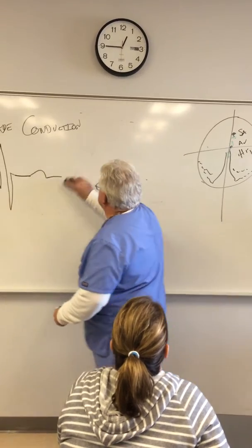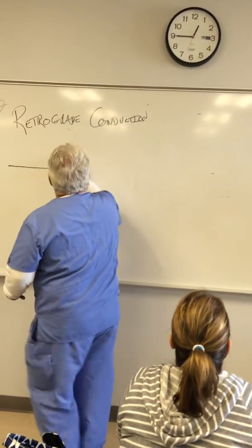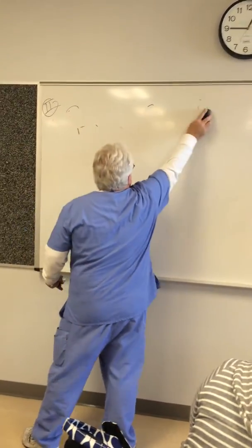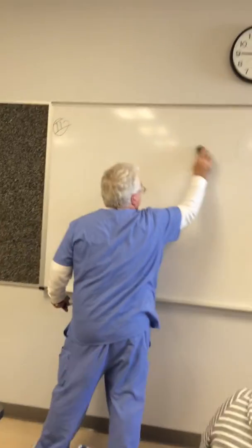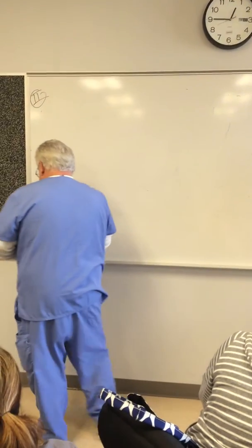Okay, no P wave, inverted P wave. Okay, let's move down. There's one more backup pacemaker before the guy croaks out.